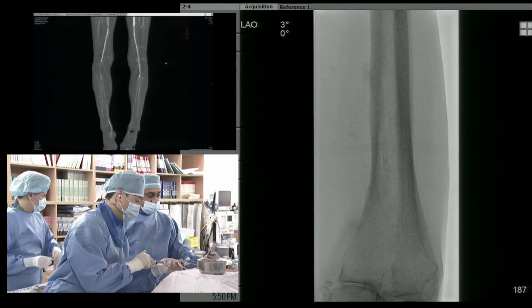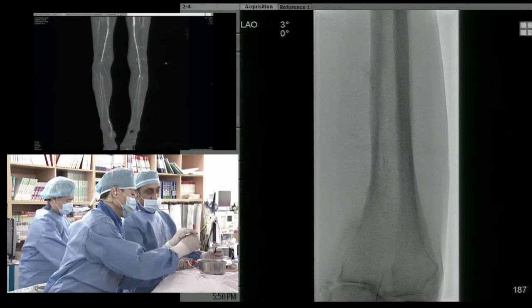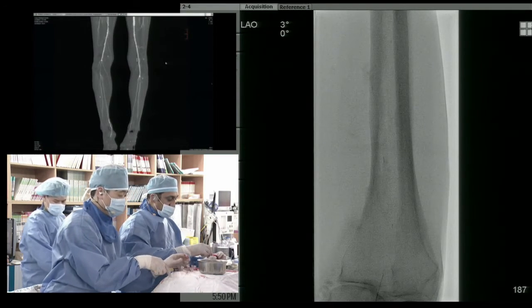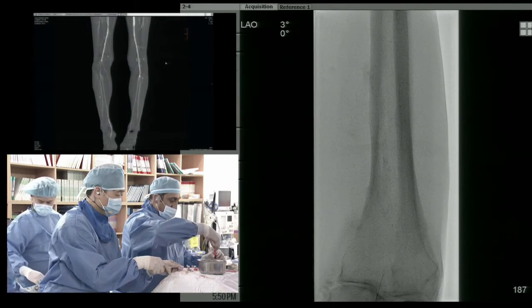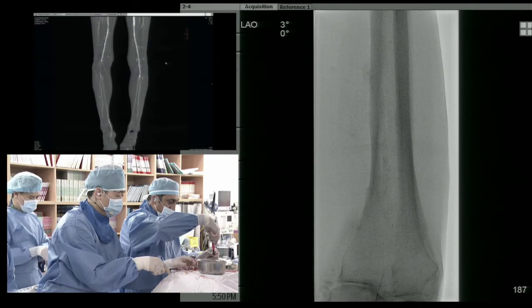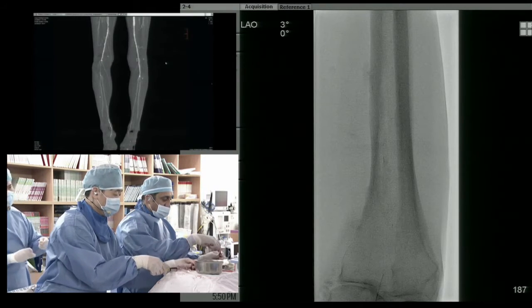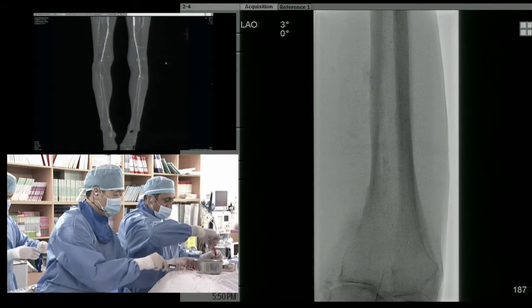Perhaps you can consider a double injection, one through the CXI and the other through the sheath. Yeah, just to do it simultaneously. I agree, that would be a good idea. Let's see what I get back here. There's nothing here which is concerning because I'm quite proximal, and even if there is a total occlusion, there should be some flow.